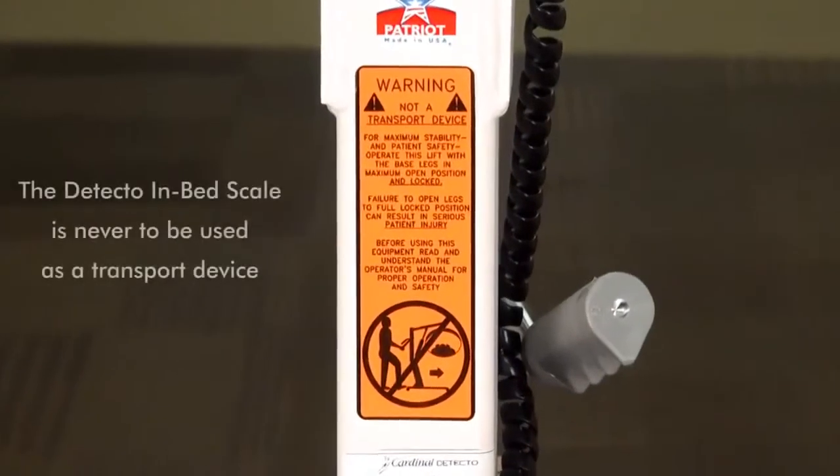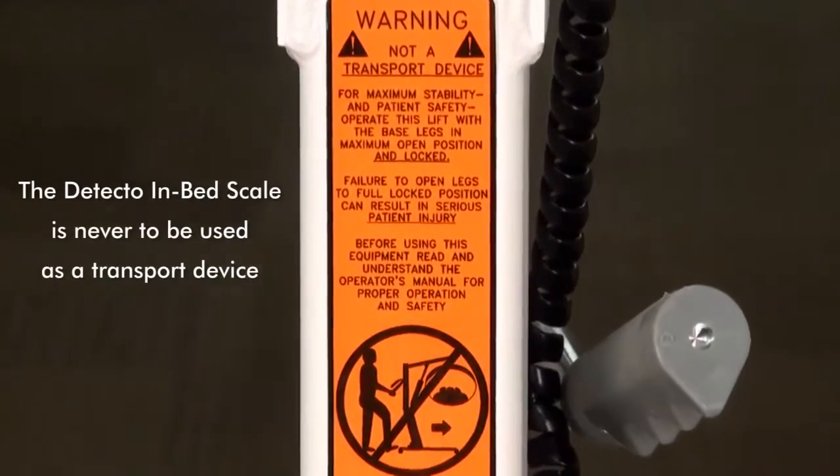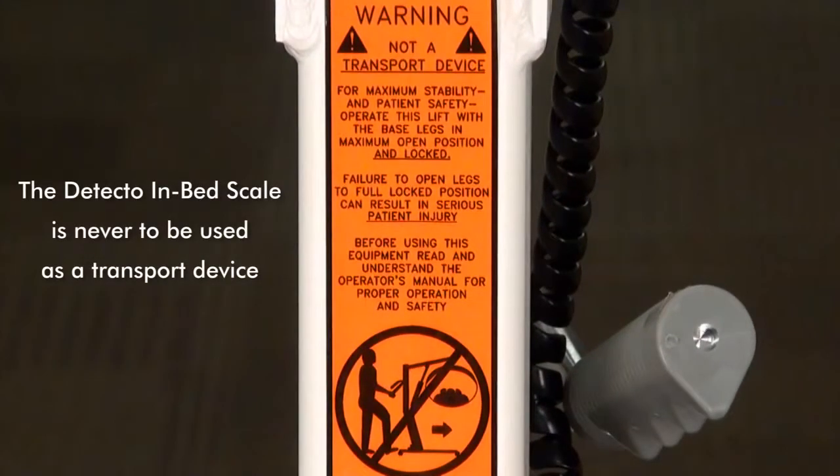Keep in mind, the Detecto in-bed scale is never to be used as a transport device under any circumstances. Damage to the scale and harm to the patient may result if it is used in this manner.